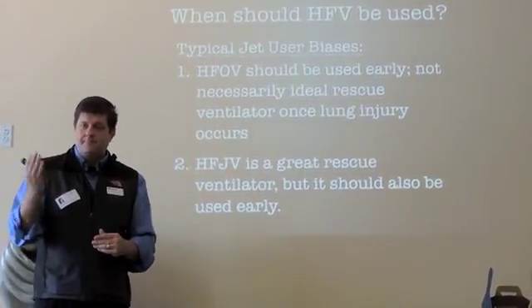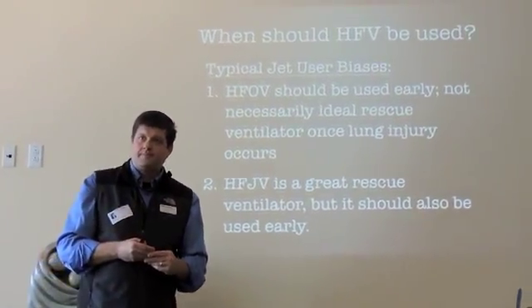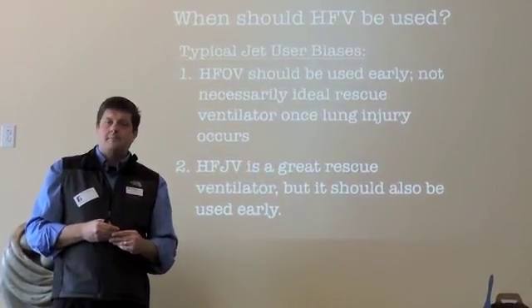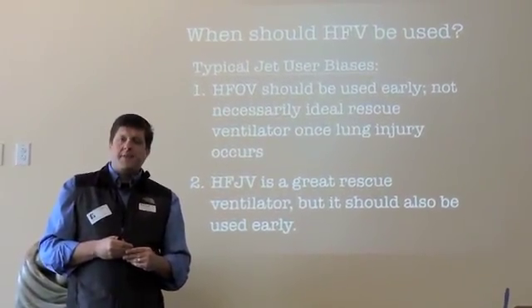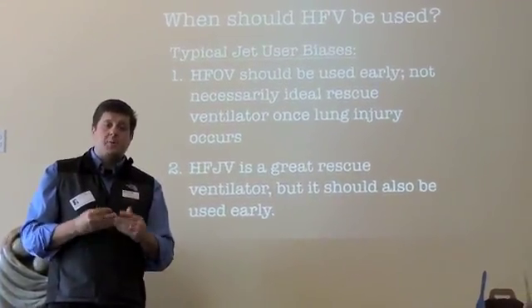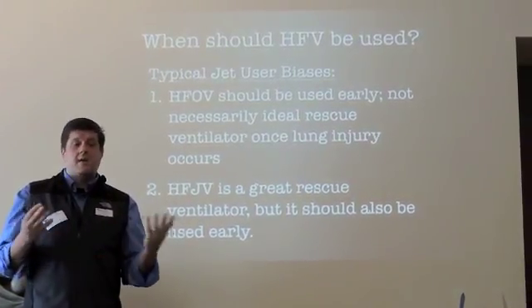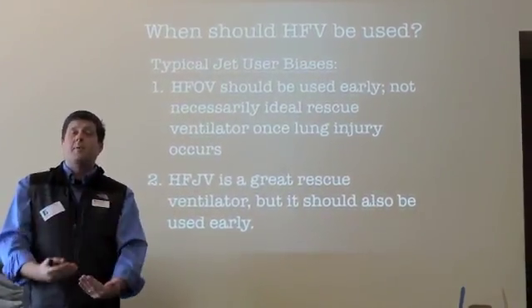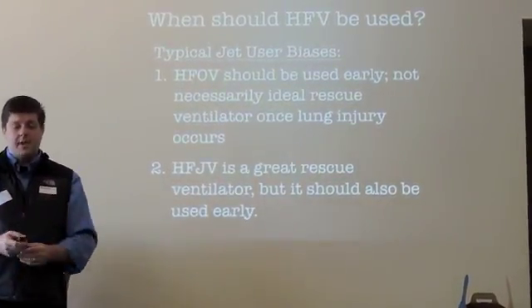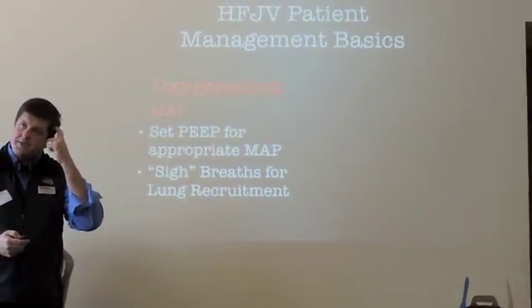So your other recommendations for fixing this, do you have another recommendation besides sedating the kid? Because I think a lot of it has to do with sedation for this kid. Yeah, because this kid is breathing so much. If he's causing that much problem, especially to the point to which he's decompensating, then we definitely need sedation for that. Other than that, no. We want the baby to breathe on their own if they can, but if it's to the point of causing issues and problems, then we need to give them a little bit.